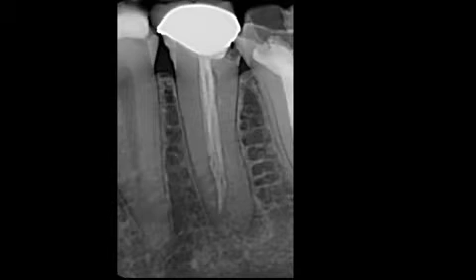This is tooth number 20, and as you can see, this tooth has been treated with a very poor root canal fill. There is a lot of space around this root canal fill that is poorly condensed. There is coronal decay around the crown, therefore the crown has to be changed. If you look down there, you can see that there is additional anatomy on the side of the tooth that reflects a potential additional canal, or maybe two.